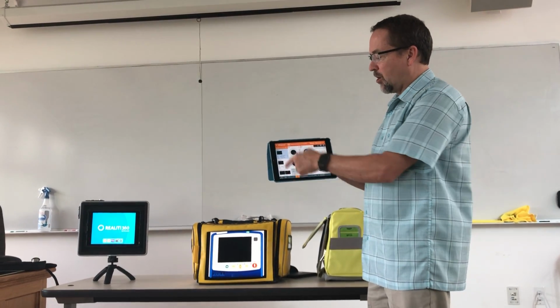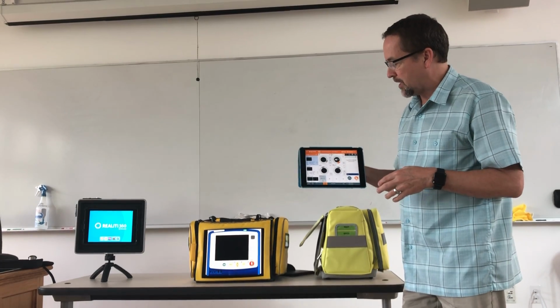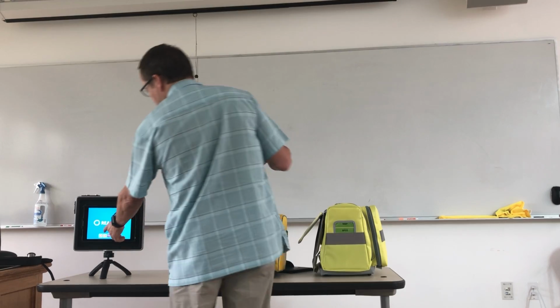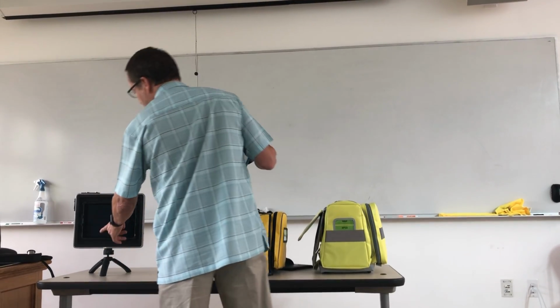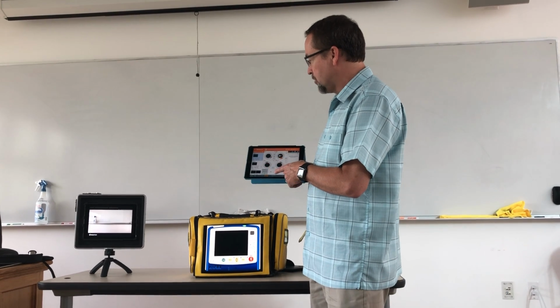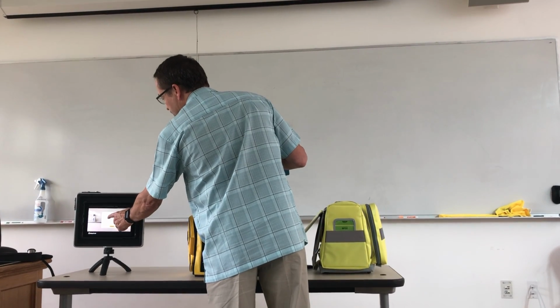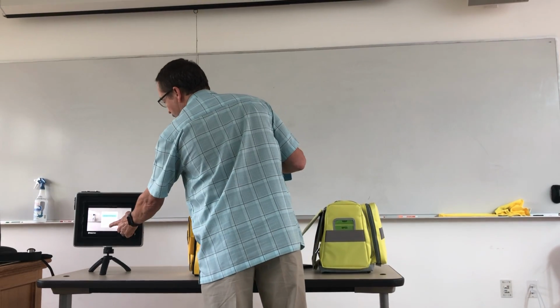So I picked a scenario, and it's going to come up with one where I've got some events already programmed in here. If I want to record the scenario that I'm doing, then I go to my camera. Again, this one is set so it opens automatically in the camera mode. And as soon as it does, it asks me, what do I want to connect to? And again, I connect to this monitor.